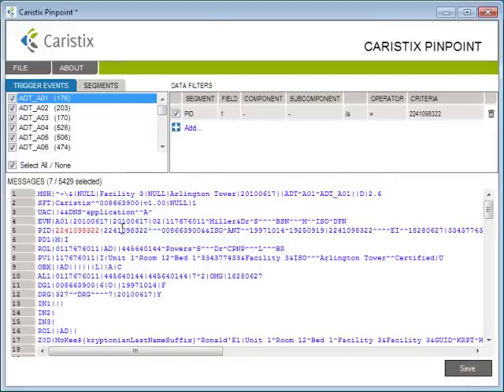Here are the messages for your test patient in the messages area. That's a whole lot simpler than scrolling through messages in Notepad.